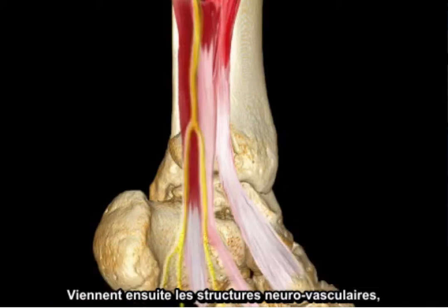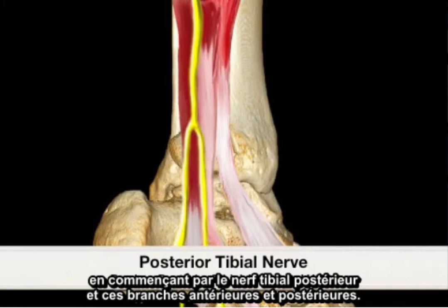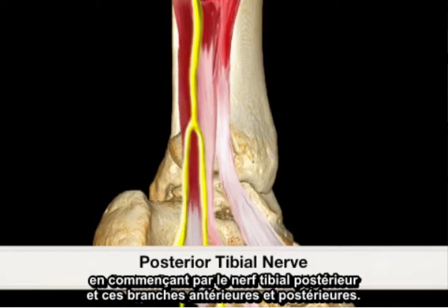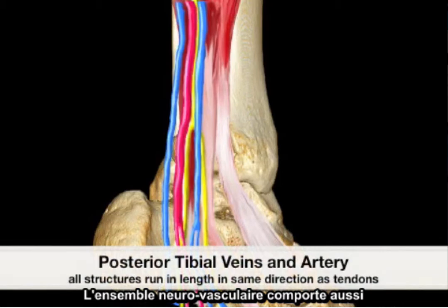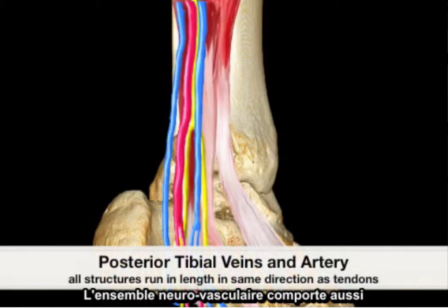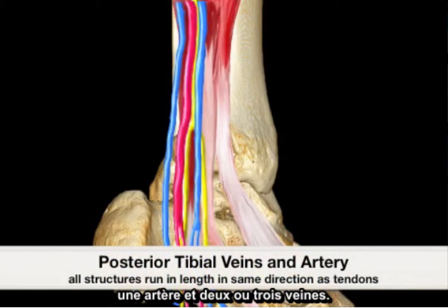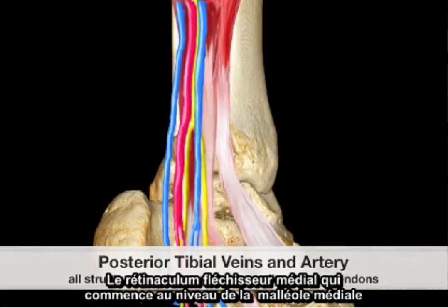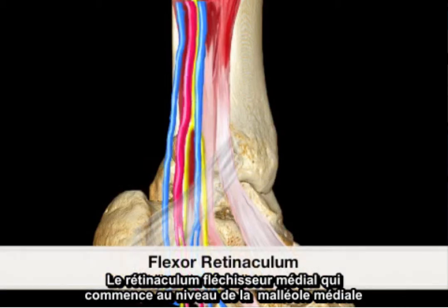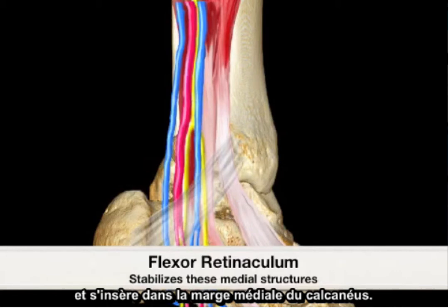Followed by the neurovascular structures, first beginning with the posterior tibial nerve and its anterior and posterior branches. The neurovascular bundle also consists of typically one artery and two to three veins. The medial flexor retinaculum begins at the medial malleolus and inserts to the medial margin of the calcaneus.